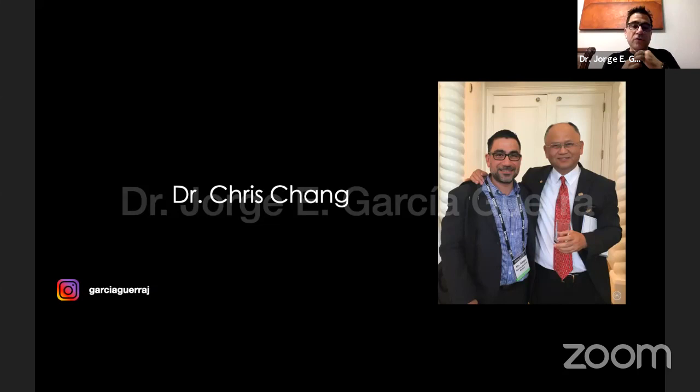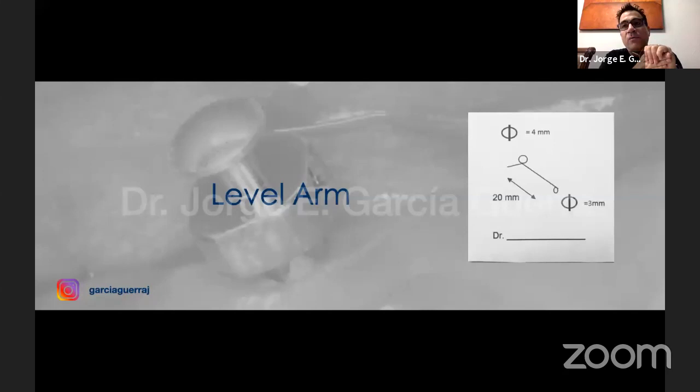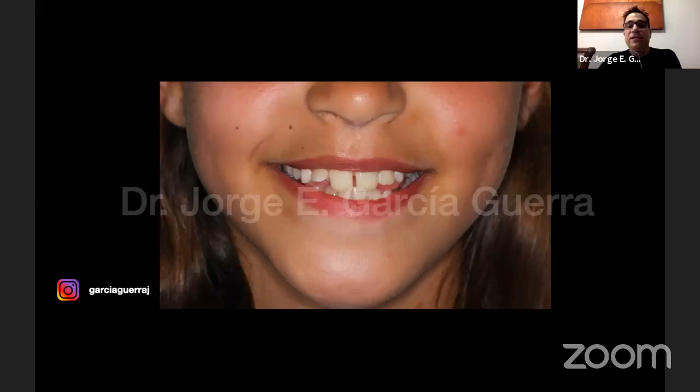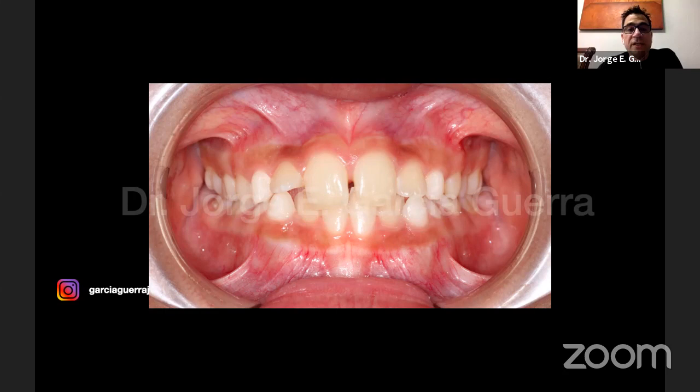What I'm going to show you here are some cases where we use this lever arm to help with the eruption of the canines. These are some cases where we have impacted canines, and I saw this first from Dr. Chris Chang. Now this is a patient around 12 years old, in mixed dentition, who was referred from a colleague. She still has some temporary teeth, but the first thing that I saw was the inclination of the lateral incisor.